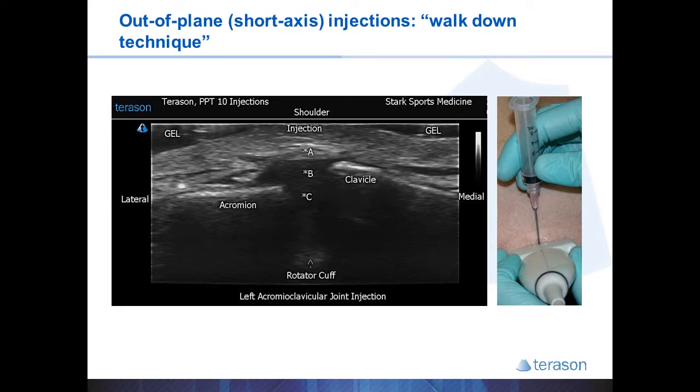In short axis we also use a walk-down technique. It's better to err on the side of superficial than to go too deep and miss your target. In this example of the AC joint, you start and you may see your white dot appear at A, which represents too superficial. You simply stop, pull the needle back to the skin, change your trajectory, and aim a little deeper. At B it may still be in the capsule, so stop, pull back, aim deeper. If the needle dot appears at C, you know you're definitely in the AC joint and can inject.